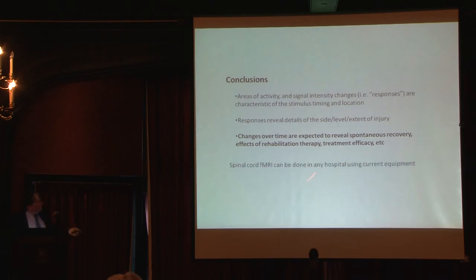And an important final point is we can do this right now in any hospital. All we need is a thermal stimulation device. And we can do each fMRI run in about 7 minutes. We can tack this onto the end of a current MRI protocol without taking a lot of time or equipment.